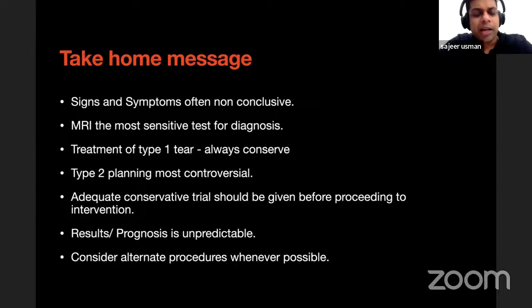I saw them on the MRI films probably once or twice. But like you said, they probably appear better if you have thin section MRIs and you keep looking at the scrolls. But I think I am still learning how to pick up these buckets.